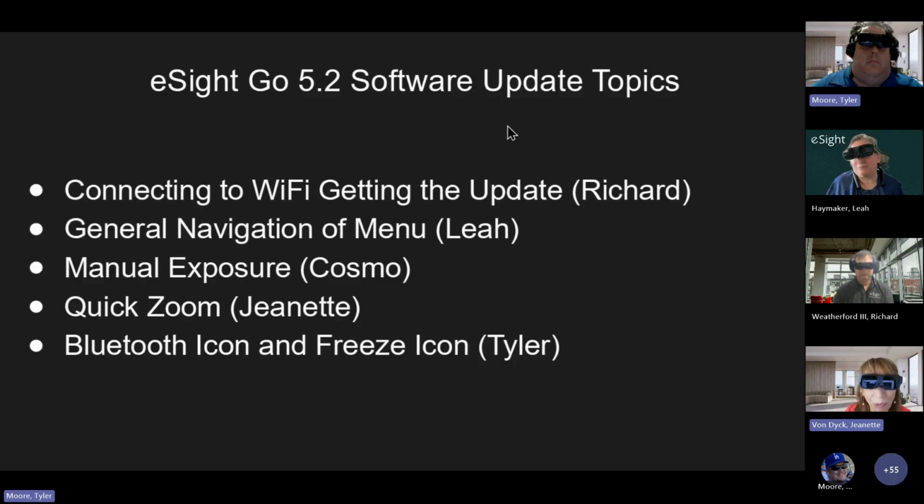So basically, what the spot zoom or the finder is, is when you're zoomed up on an image and you want to quickly zoom out and have an overall picture. You're going to press that button on the top left-hand side, and it's going to quickly zoom you out and give you the opportunity to focus on something specific and then zoom back up on it.